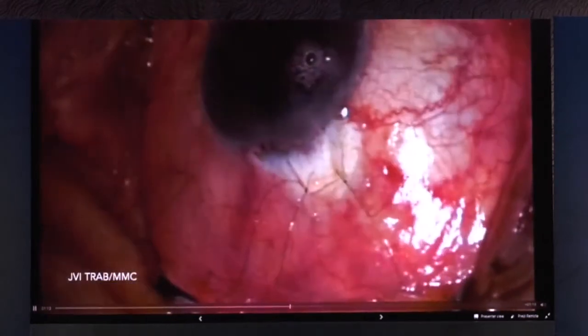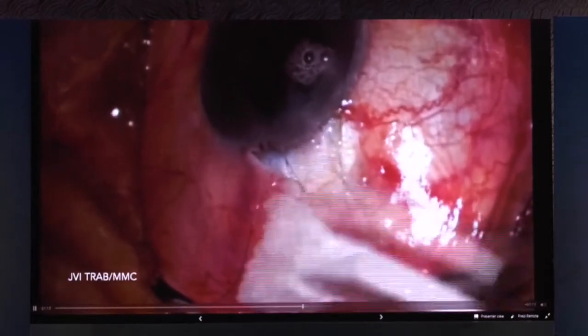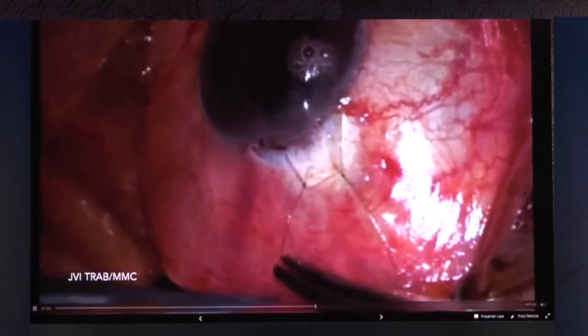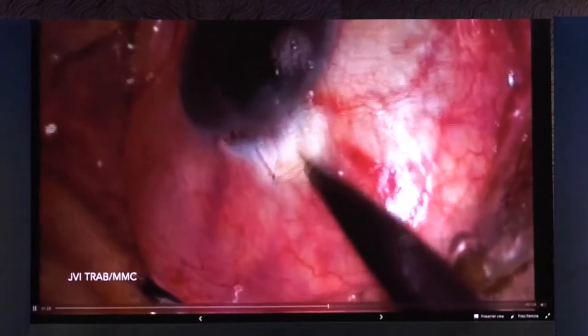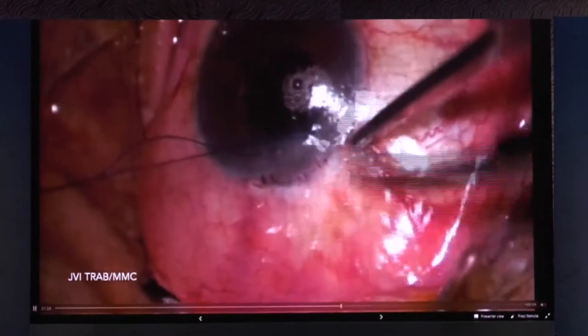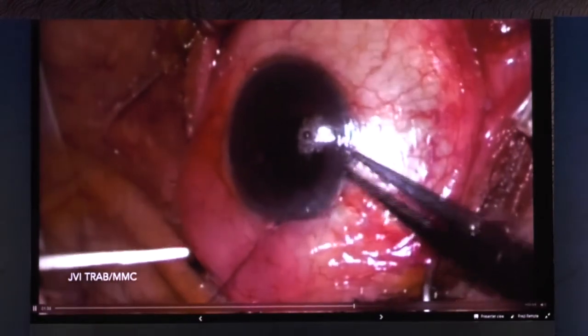So here I'm putting in BSS, and I'm testing the egress. I'm quite happy with the egress. I'm quite happy that the anterior chamber is being maintained at roughly mid-teen sort of pressure. And then I lock it off with a perpendicular locking suture. And then I close up my conjunctiva using two wing sutures, or two purse-string wing sutures. And for posterity, I add in the mattress suture, because all of us are audited.